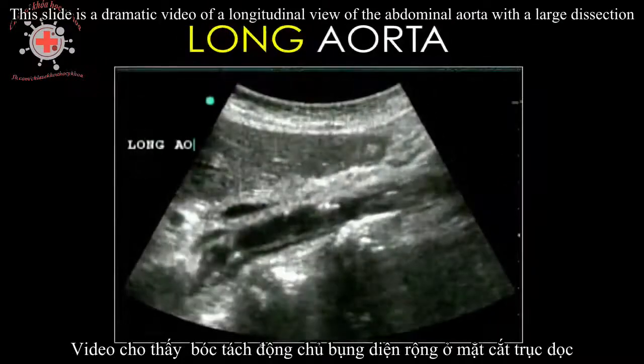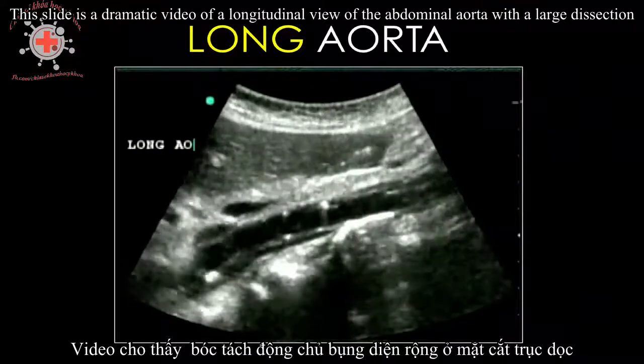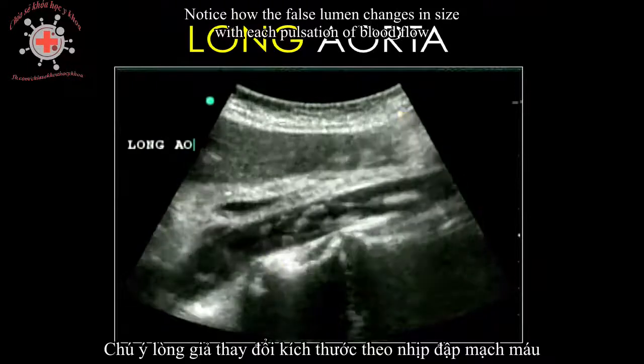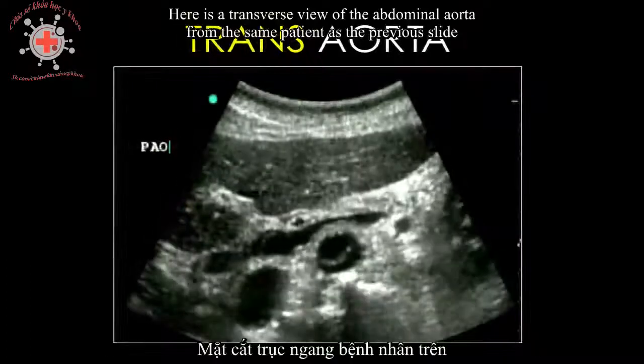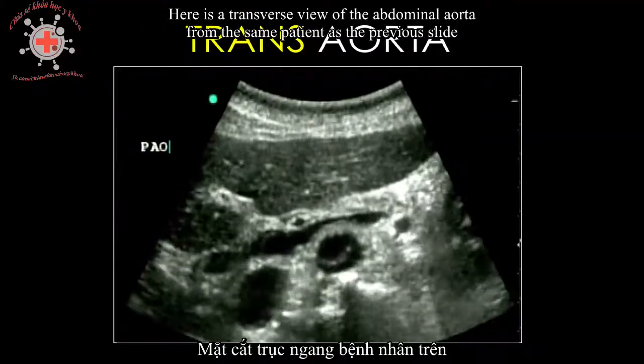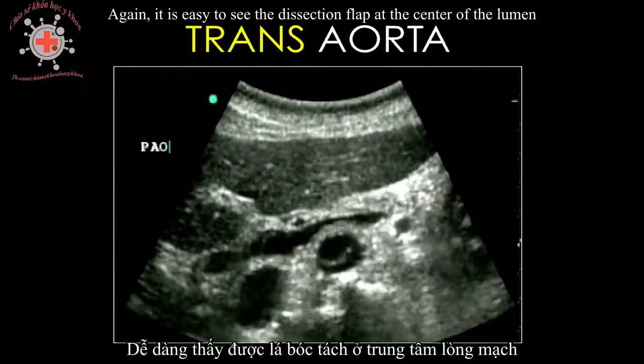This slide is a dramatic video of a longitudinal view of the abdominal aorta with a large dissection. Notice how the false lumen changes in size with each pulsation of blood flow. Here is the transverse view of the abdominal aorta from the same patient as the previous slide. Again, it is easy to see the dissection flap at the center of the lumen.